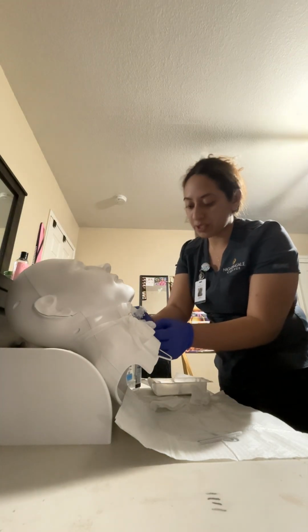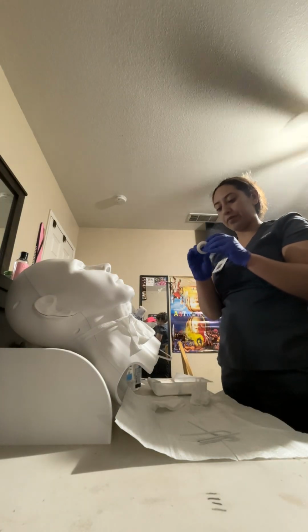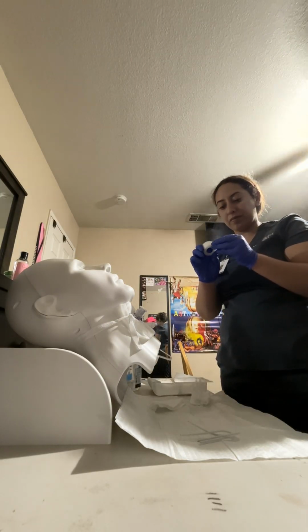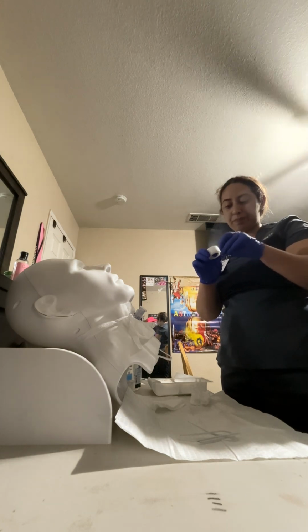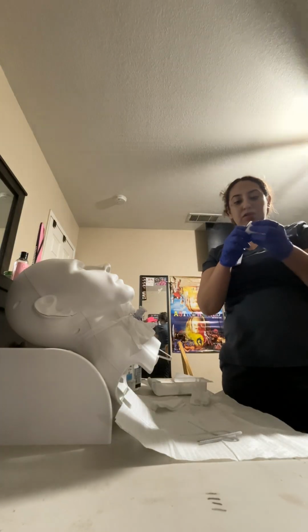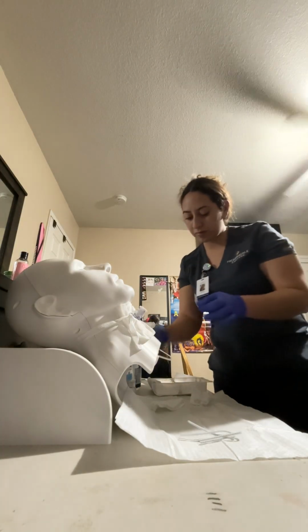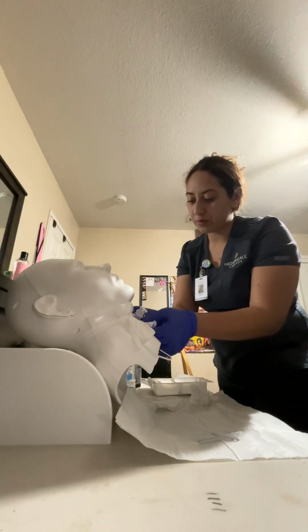So I'm going to do this side first. And apply a little tape. And there we go. We will tape that down.